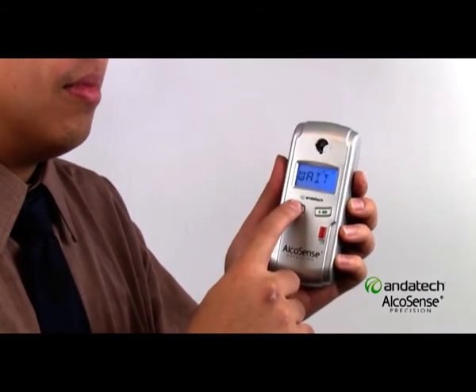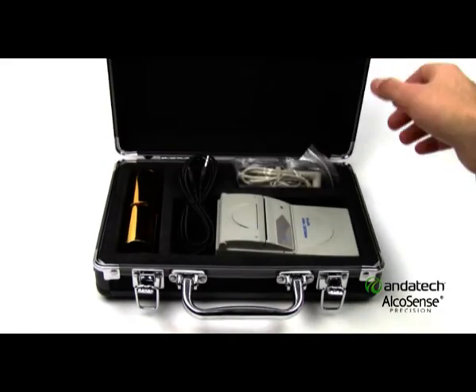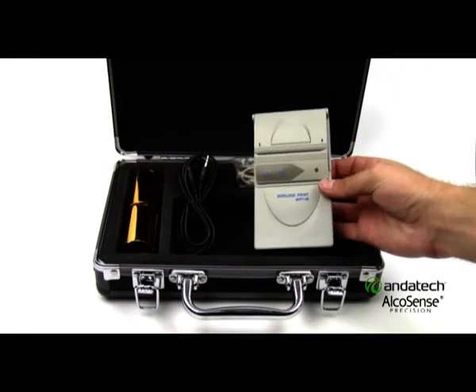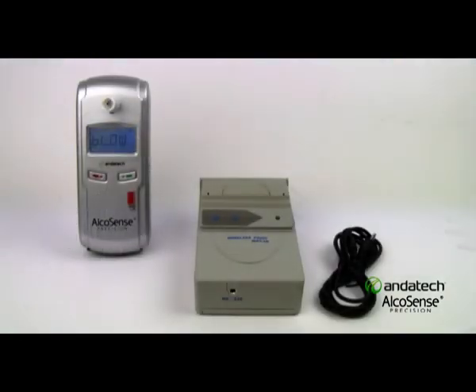Press the red button and wait for your reading. The AlcoSense Precision also features an optional thermal printer, which provides a detailed printout of the reading. The printer can be connected via the connection point on the side of the Precision.